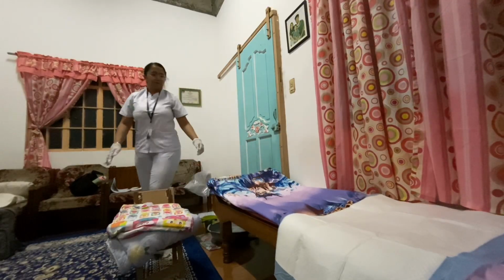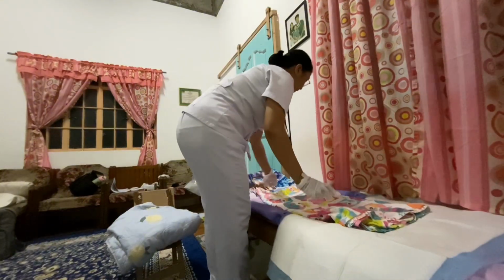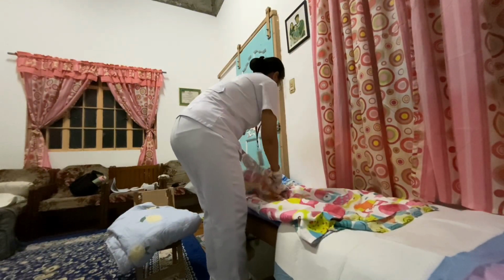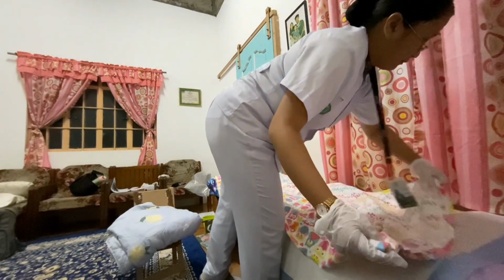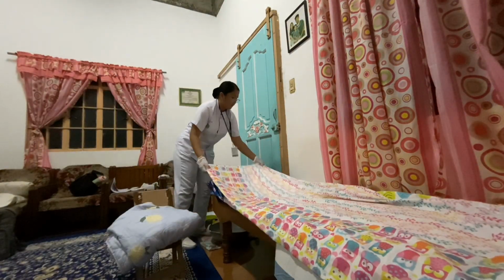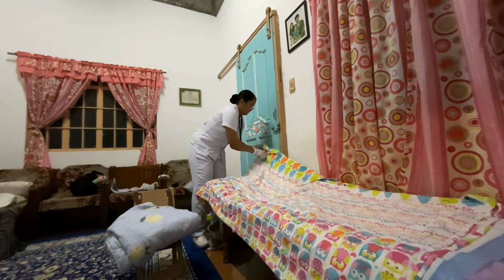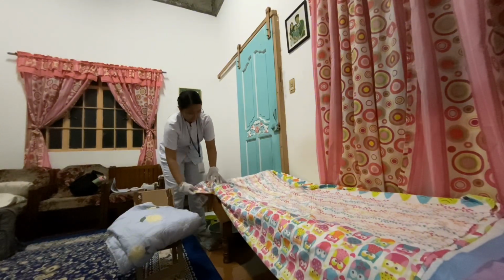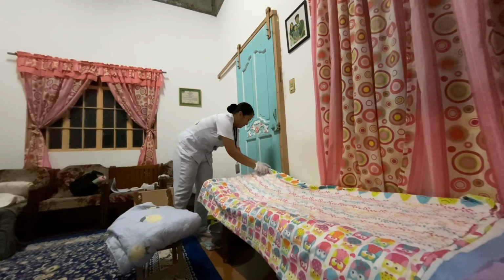Next, I'm going to move to the other side of the bed and secure the bottom linens. Blanket or the top linen. So, this one naman po. I-cover po sila natin. Ganito. So, para ma-cover up po yung dito. Ayan.